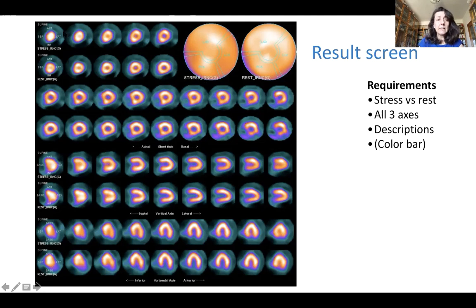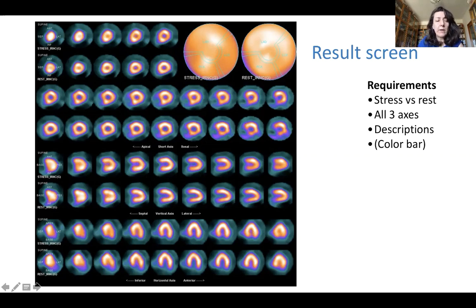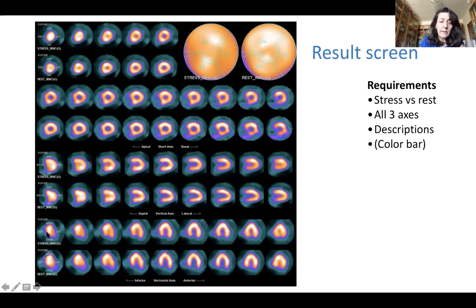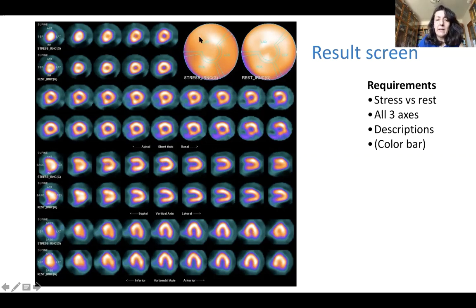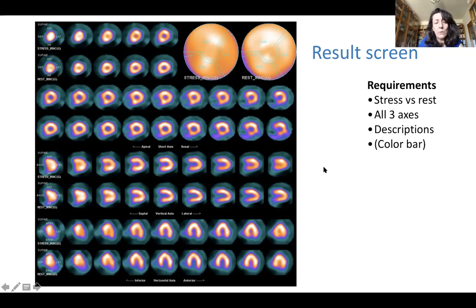In the short axis representation, the first row shows stress and the second row shows rest, with slices from apex to base well-oriented in both. The vertical axis shows stress and rest from septal to lateral wall, and the horizontal axis from inferior to anterior wall, with the right ventricle visible. In a normal scan, tracer uptake appears very similar all around the left ventricle with no difference qualitatively between stress and rest.